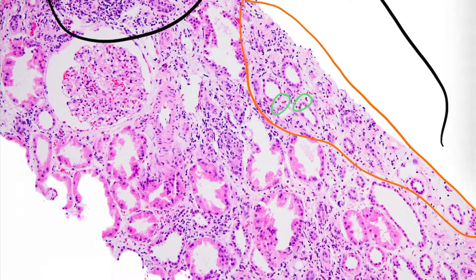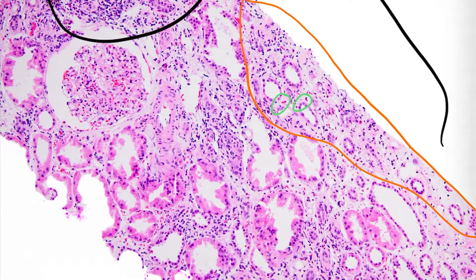This biopsy demonstrates moderate interstitial inflammation, about 30 to 40 percent of the entirety of the unscarred cortex, consistent with an I2, and as we saw earlier, demonstrated moderate tubulitis. These two findings put together, in the absence of SV40 staining or positive BK titers, are compatible with acute T-cell mediated rejection, Banff grade 1A.